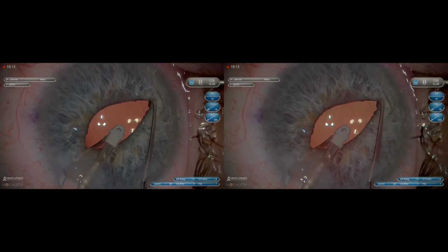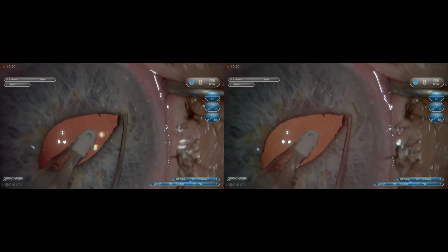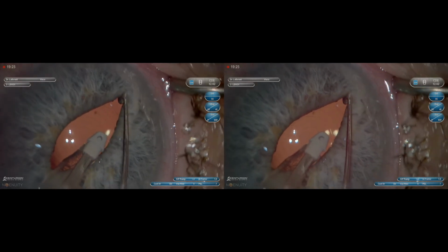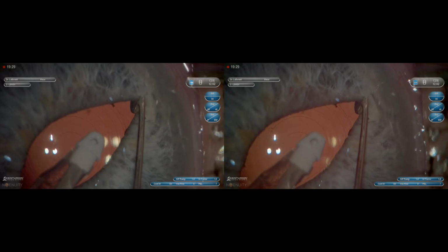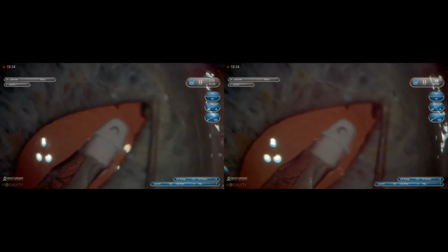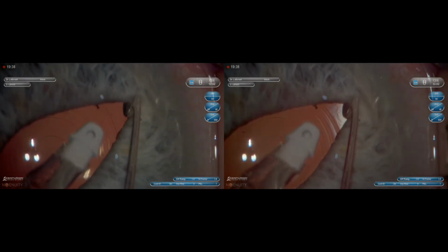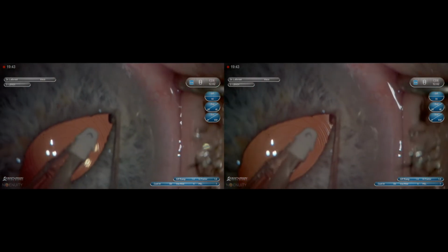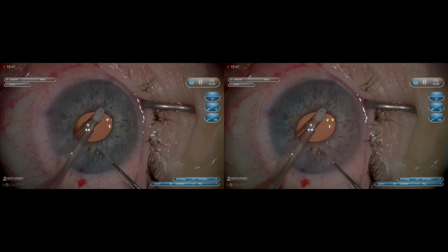This is just to demonstrate that as you zoom in, it remains in great focus, so you can go under higher magnification to verify, in this case, that the intraocular lens is within the bag and under the anterior capsule. So the Ngenuity is able to keep the colorization stable. You can have a good red reflex, but you can also visualize the details under higher magnification if necessary.